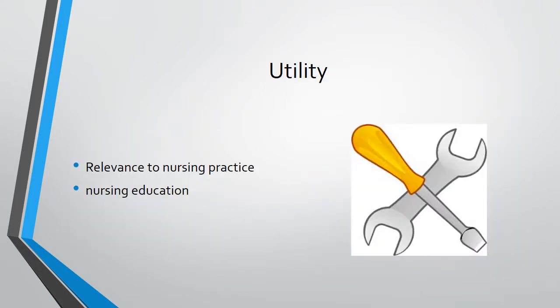Diabetes Pilot and applications like it are relevant to everyday nursing practice because they are so easy to use. Smartphones and tablets have become standard accessories in our society. Using a patient's mobile application to teach him to manage his diabetes is valuable. The patient can begin working with the program while he is still under the nurse's care. The nurse can track the progress and use the trends shown through graphing and charting as valuable teaching tools. In addition, the nurse is available when questions arise as the patient becomes more educated.